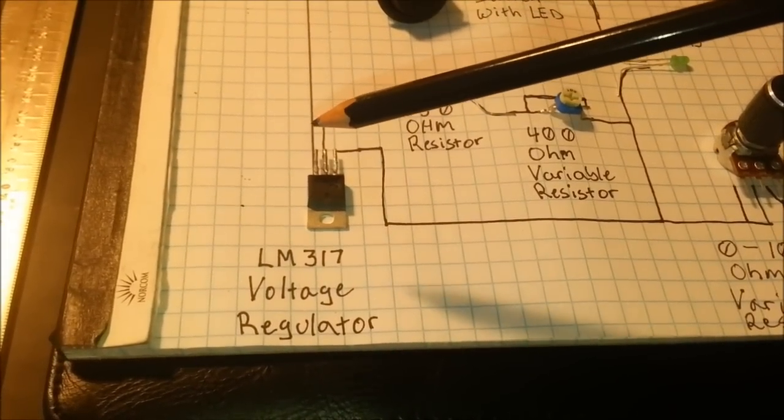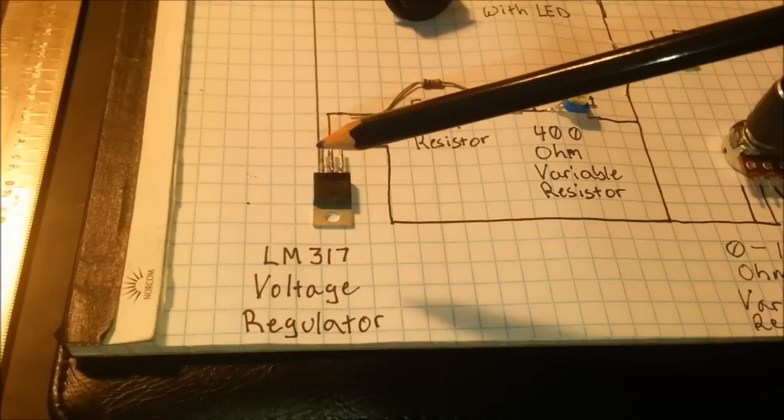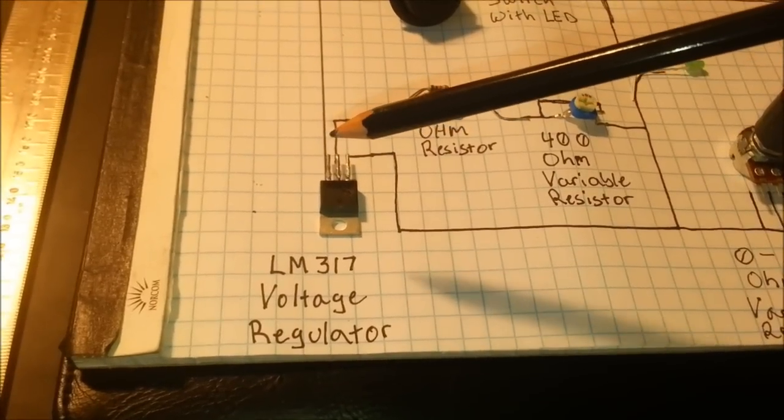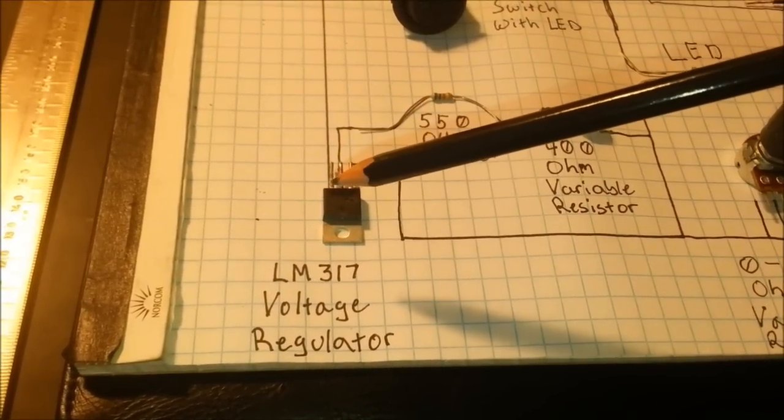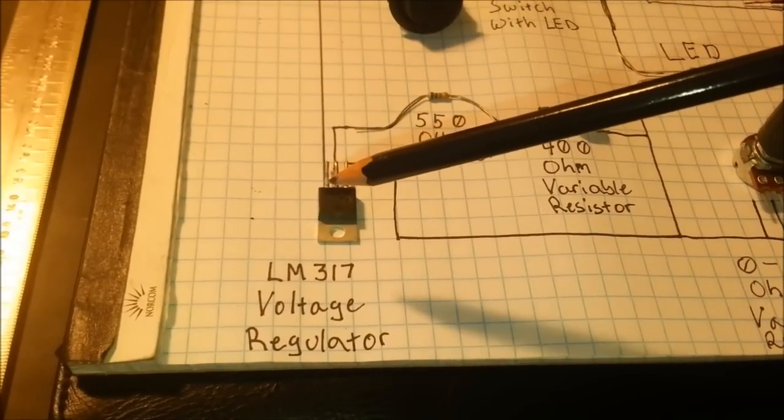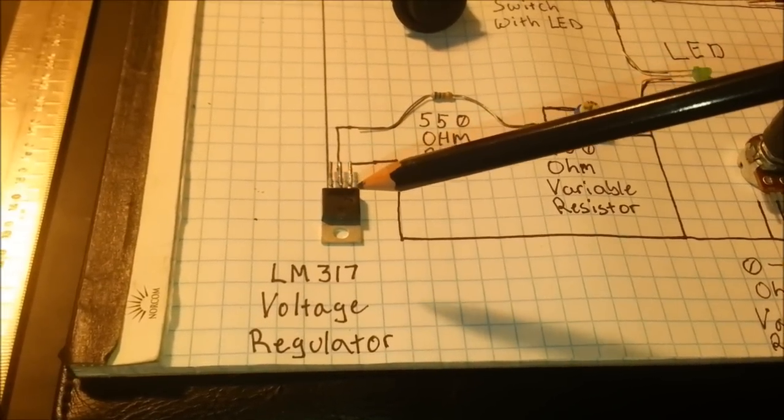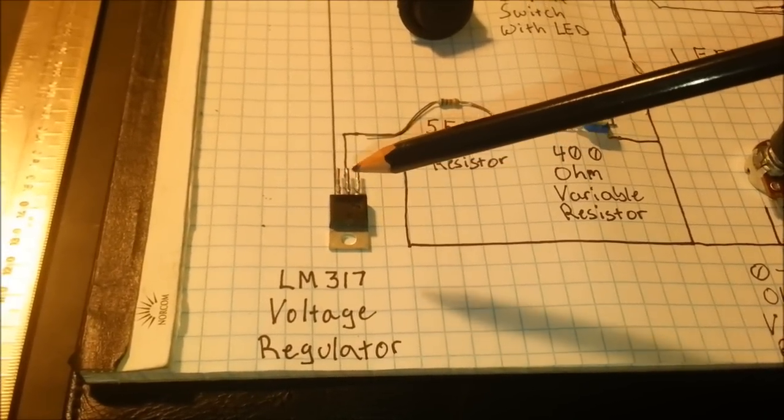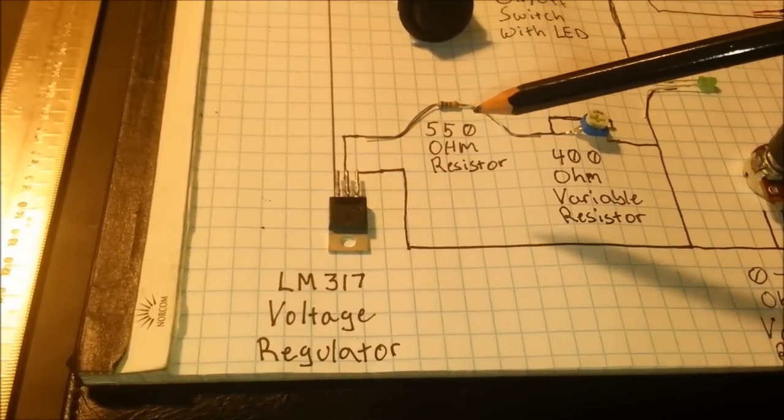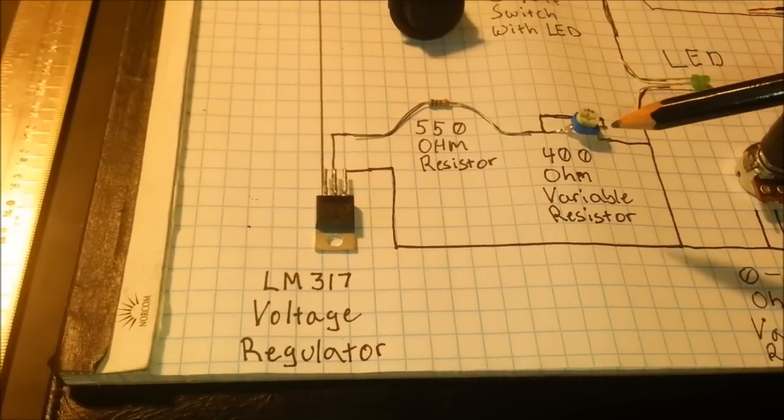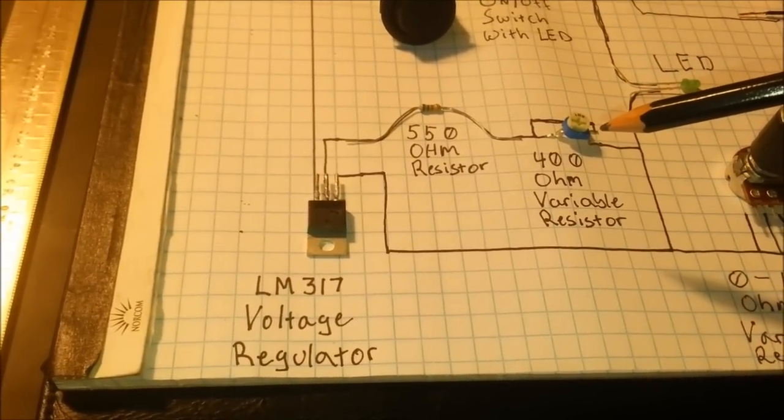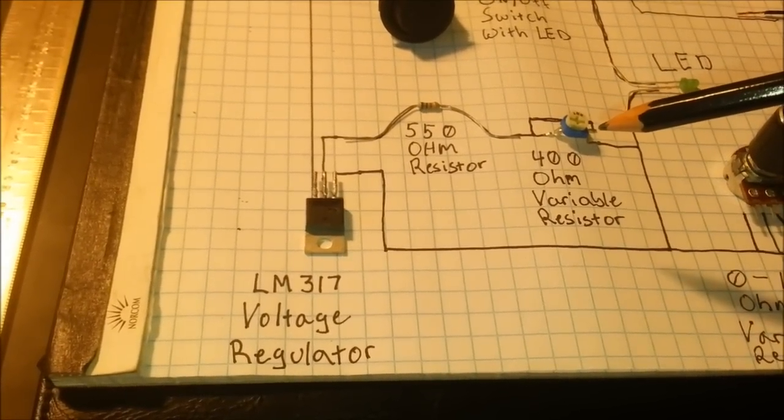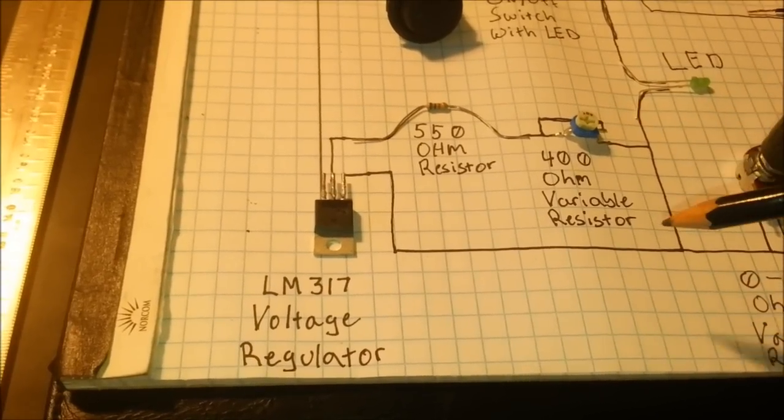So then you come down to your LM317 voltage regulator, which we're going to make it into a current regulator. Power goes into pin 3. I've got it upside down, so that's actually pin 3 right there. In the middle pin you're going to use a 550 ohm resistor, and then you're going to go to a 400 ohm variable resistor. You're going to use that to set your current.